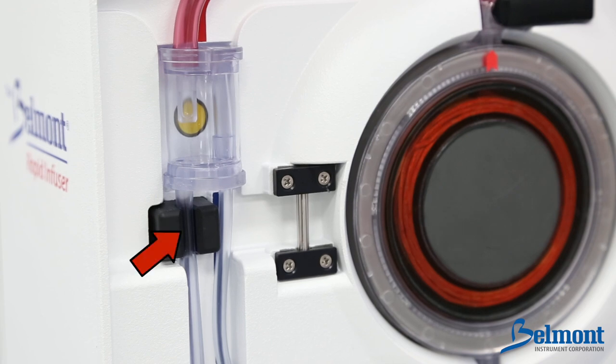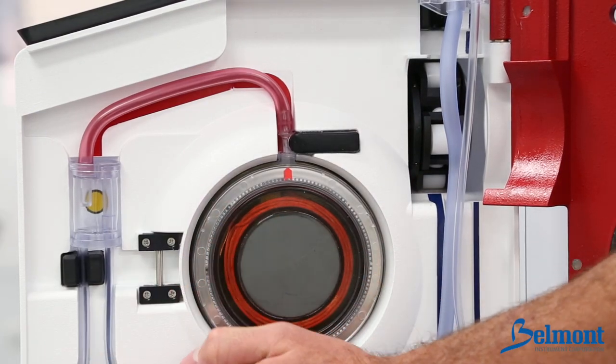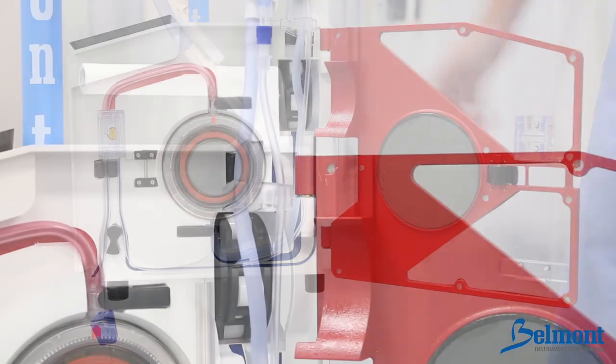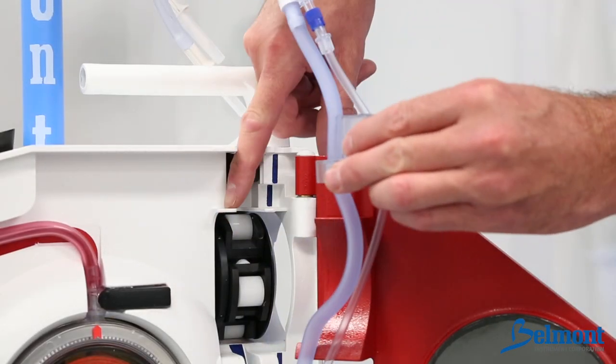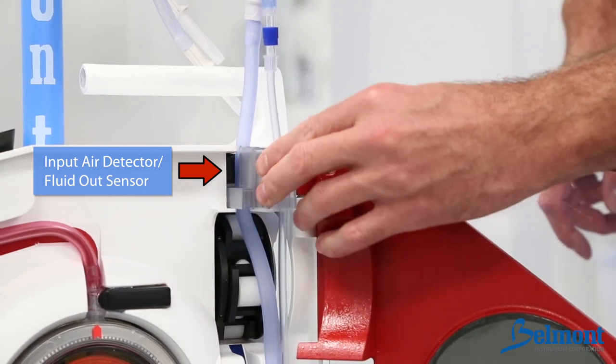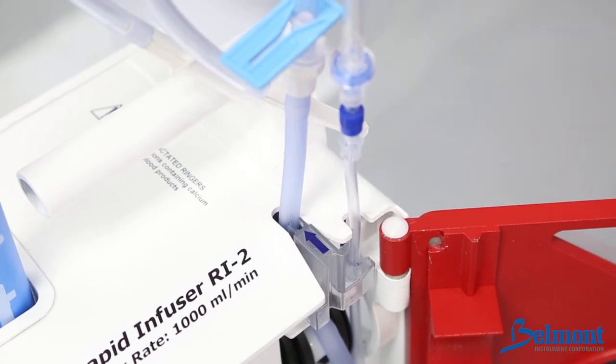Press the infuse line into the secondary air detector to the left of the patient safety valve wand. Note: the infuse line should be at or below flush within the air detector. Place the thinner recirculation line to the right of the air detector and to the right of the valve wand. Next, fit the interlock block on top of the shelf. The blue arrow should be upright pointing towards the ultrasonic air detector. The interlock block will be flush with the top of the machine.